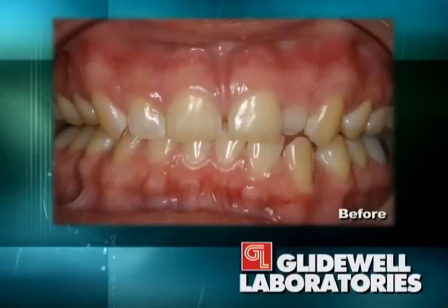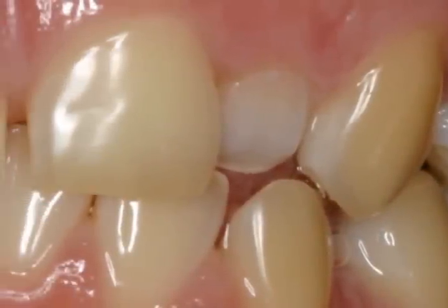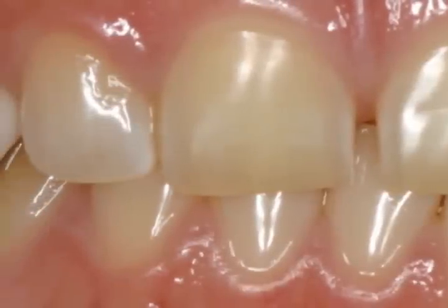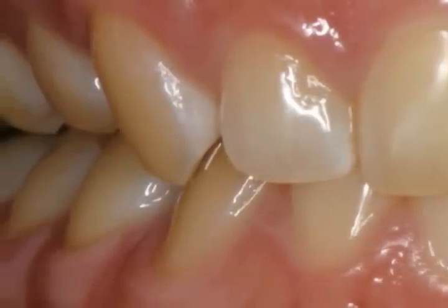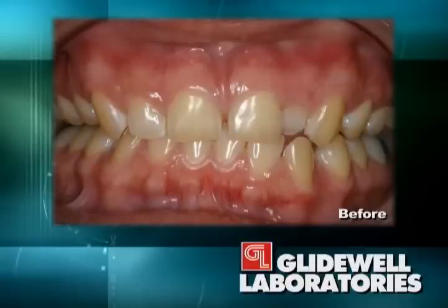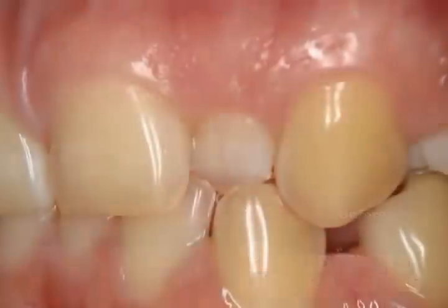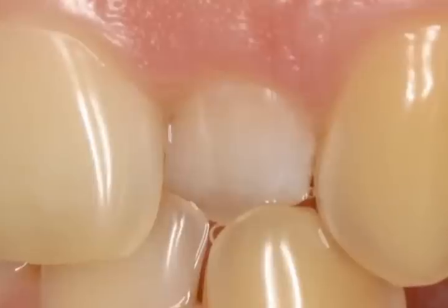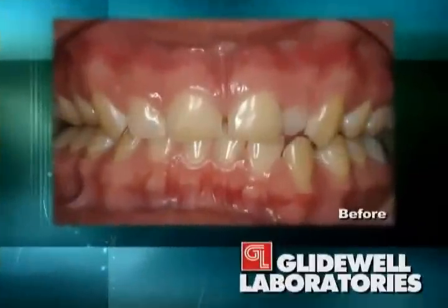This was a good opportunity to take a study model, send it to my technician, and have them tell me what they'd like me to do. We'll look at the diagnostic wax-up later. A decision was made to use ThinPress — our pressed porcelain at Glidewell — which can be used for no-prep veneers, minimal prep veneers, traditional veneers, or full crowns. Tooth number 10 will be prepared for a full crown to move it to a more facial position. We'll do prep veneers on teeth 6, 7, 8, 9, and 11, and no-prep veneers on teeth 4, 5, and 12.